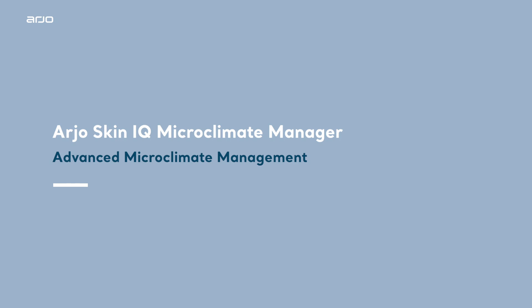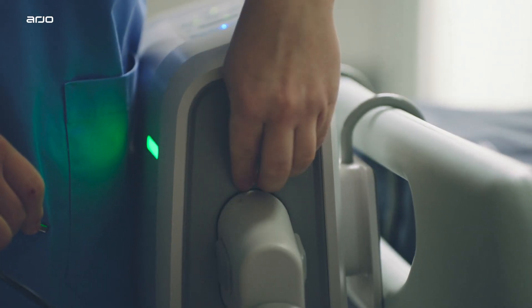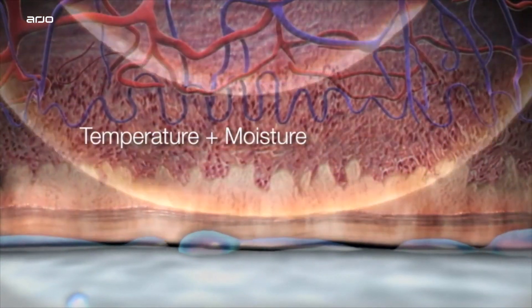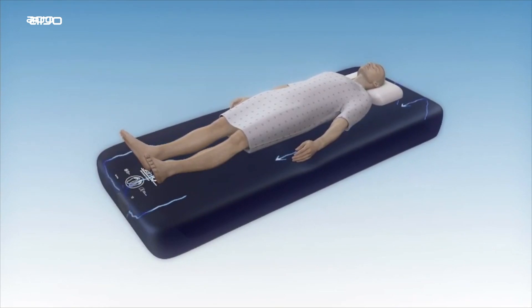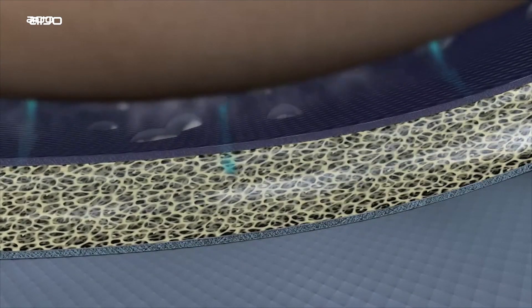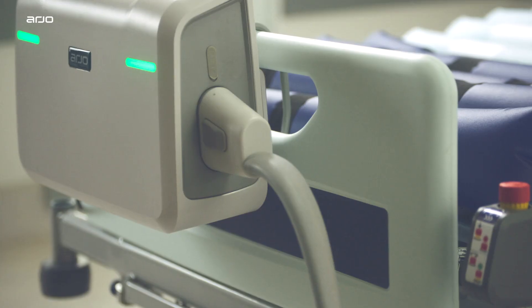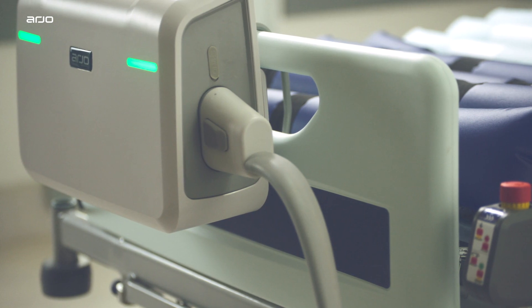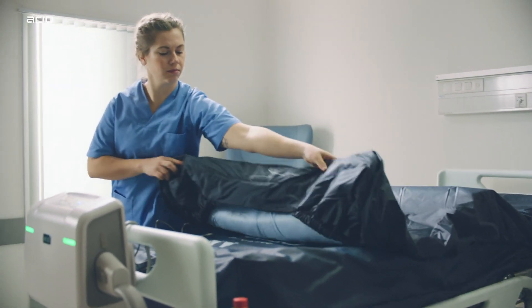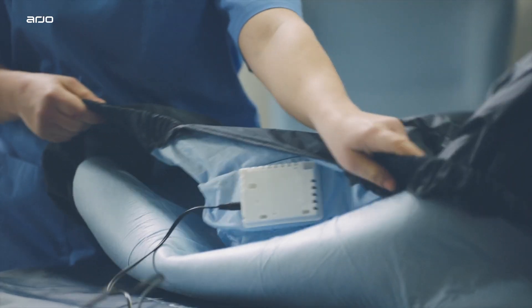Direct compatibility with Arjo Skin IQ Microclimate Manager. With the option to add Skin IQ by simply plugging the Skin IQ coverlet into the Oralis pump, it makes the provision of microclimate management simple, addressing risks associated with temperature and moisture build-up between the skin and support surface using negative airflow technology. The Skin IQ port on the side of the pump provides a direct plug-and-play connection with the Skin IQ coverlet.